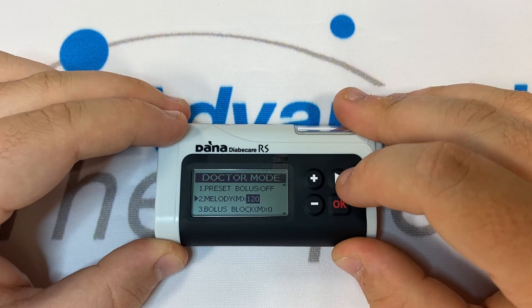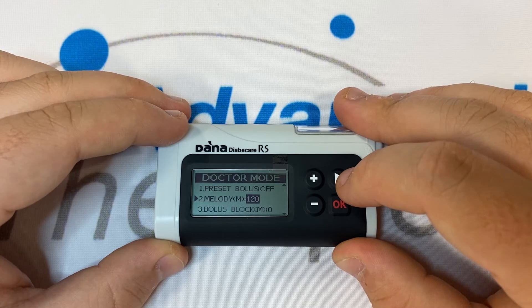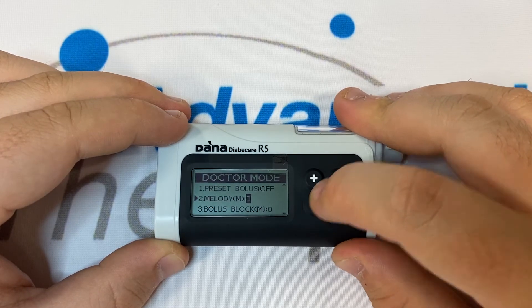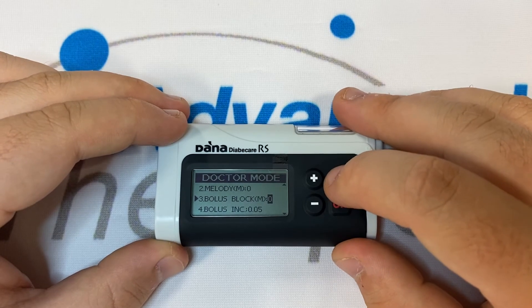Two hours after a bolus, the pump will alarm to remind you to check your glucose. If you don't wish to be reminded, set this number to zero. Number three is Bolus Block — this is a limit on how many boluses you can perform in a time frame that you set.